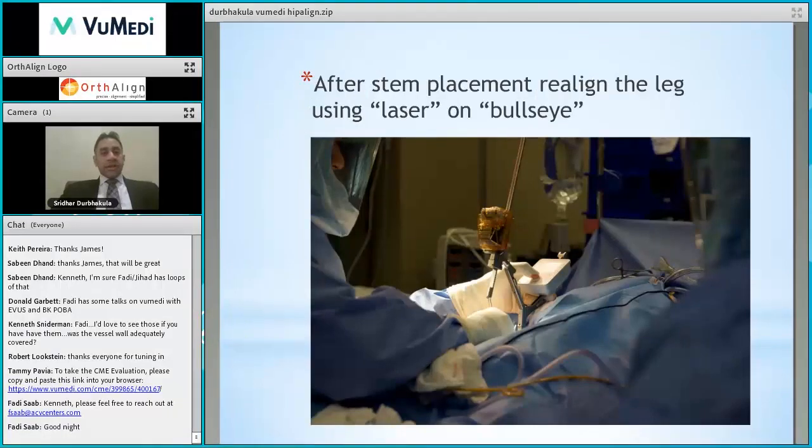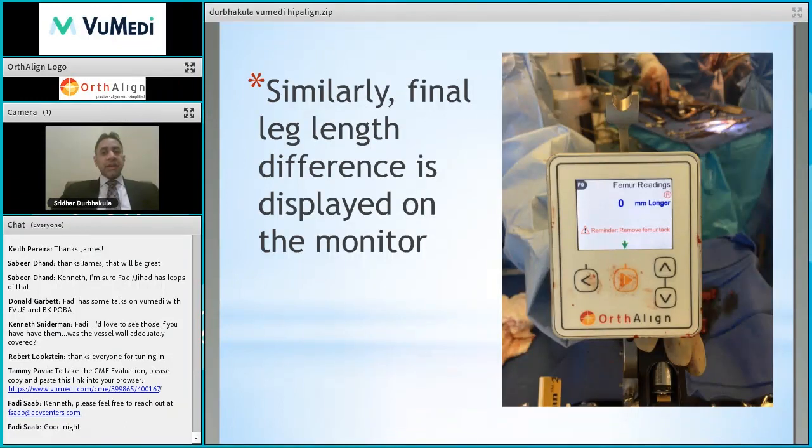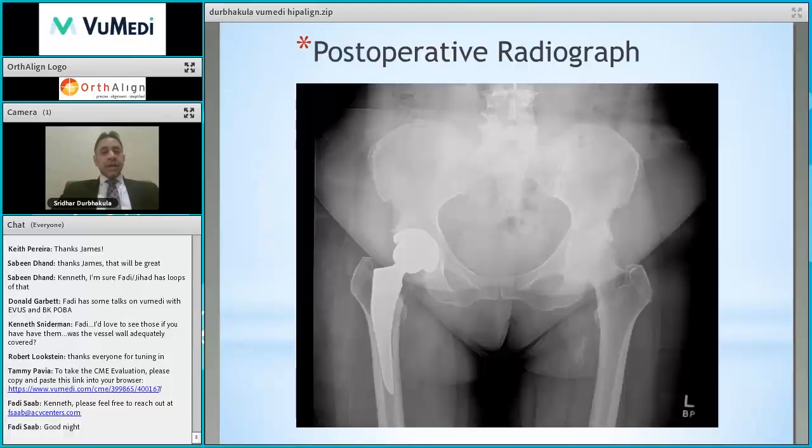So essentially we're realigning the bullseye for the leg after we put in our stem, and we find the pin, and we're able to access and measure the pin as well. And in this case, we're 0 longer, which is really what we wanted. We wanted the stem to be neutral. So now we have reproduced our leg lengths to the exact preoperative measurement. And there's our postoperative radiograph, so mission accomplished.